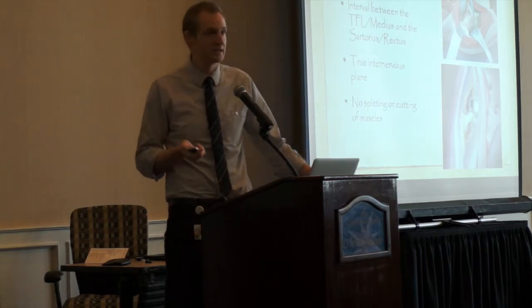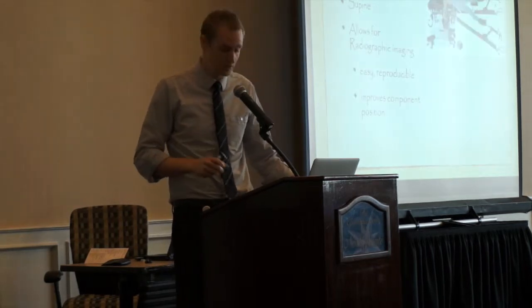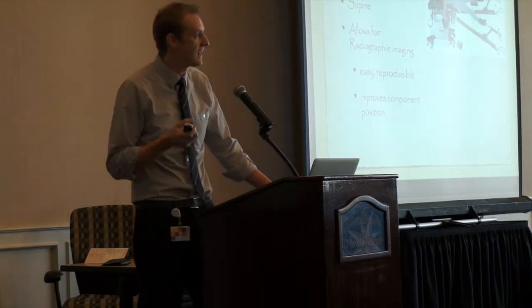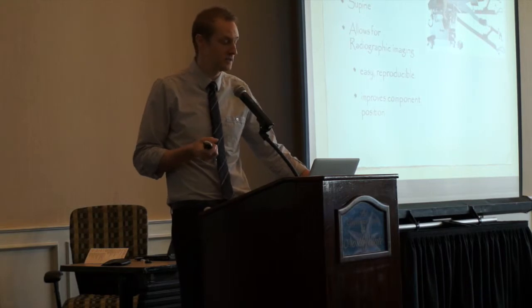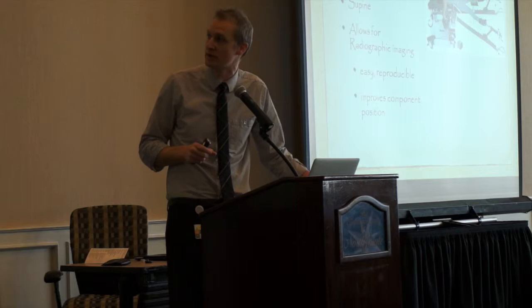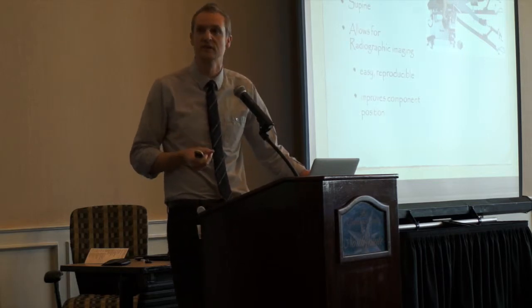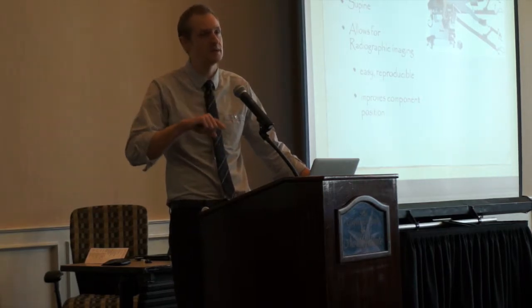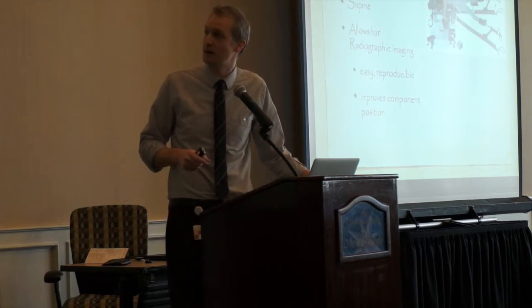Again, there's no splitting and there's no cutting of any muscles prior to actually reaching the hip joint. Again, the patient is in a supine position. The picture up here is the operative orthopedic table that we use to perform the procedure. Towards the end, when we do a case example, it'll become a little bit more clear. But positioning the leg in different areas of space is how it allows us to gain access to both the acetabulum, the socket side of the hip, as well as the femoral head, or the ball side of the hip.